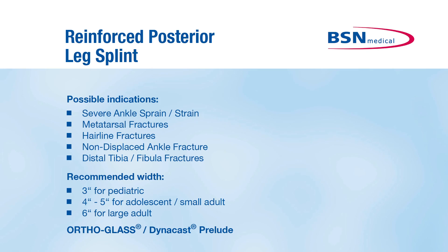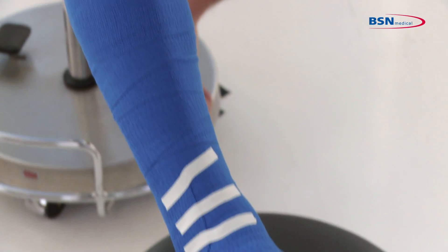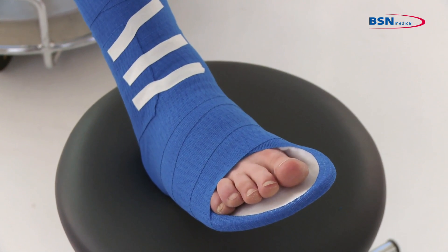The reinforced posterior leg splint with its butterfly shape is the ideal immobilization form for severe ankle sprains, strains and fractures.